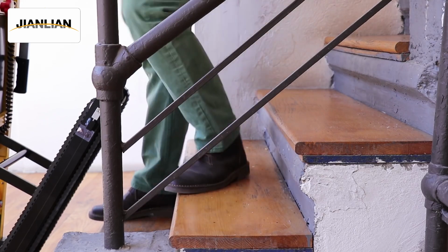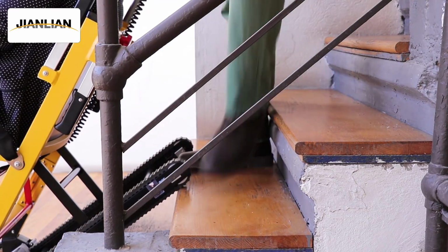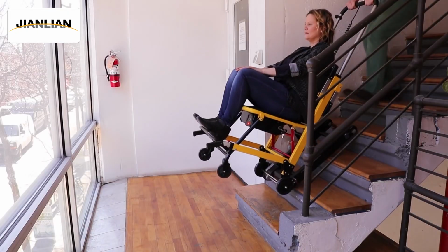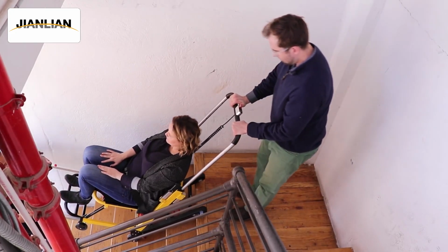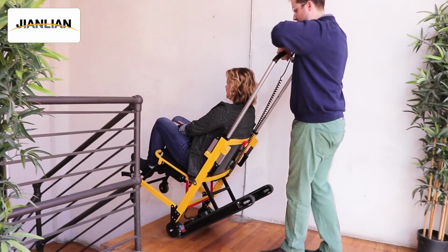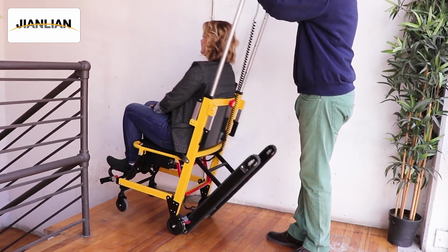Lean the handlebar towards you to tilt the stairlift back until the treads are resting on the stairs. Then press the green button while firmly gripping the handlebar and pulling it towards the stairs. When you reach the top of the stairs, continue moving backward until the front wheels have cleared the edge of the landing. Only then, lean the handlebars forward to return the stairlift to its bottom 4 wheels.